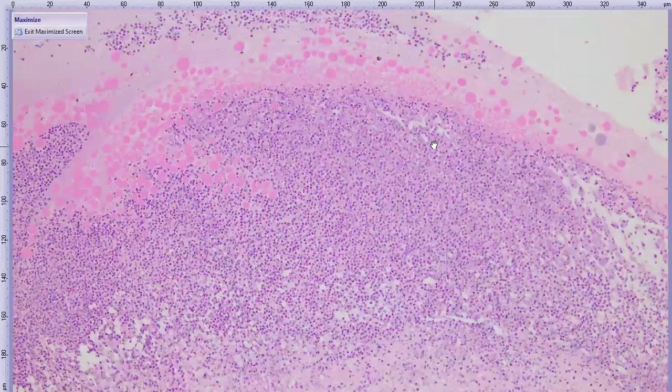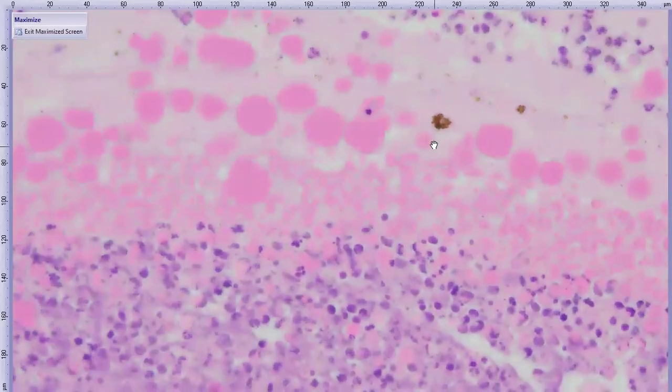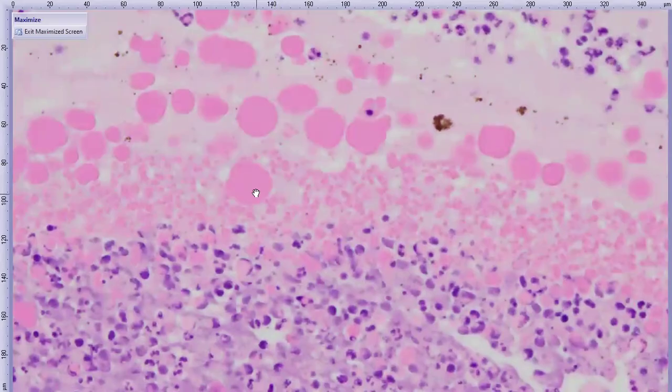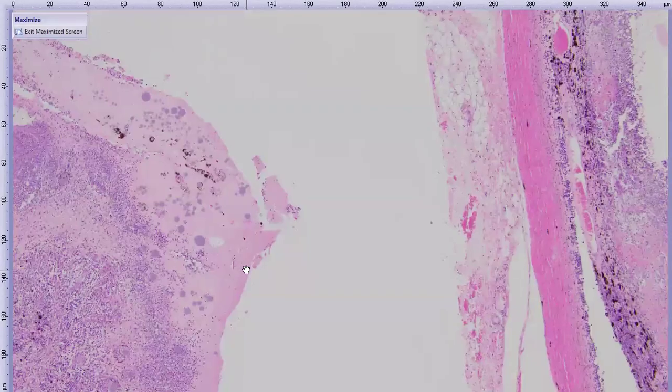We're going to nudge ourselves back over this way. There we go. So all that pink stuff that was forming a halo is actually these globules of extracellular protein. And they're both free in the vitreous/posterior chamber and being phagocytized by these cells next door. So it's very interesting protein. And if we want to figure out where that protein came from, let's walk over to the lens.